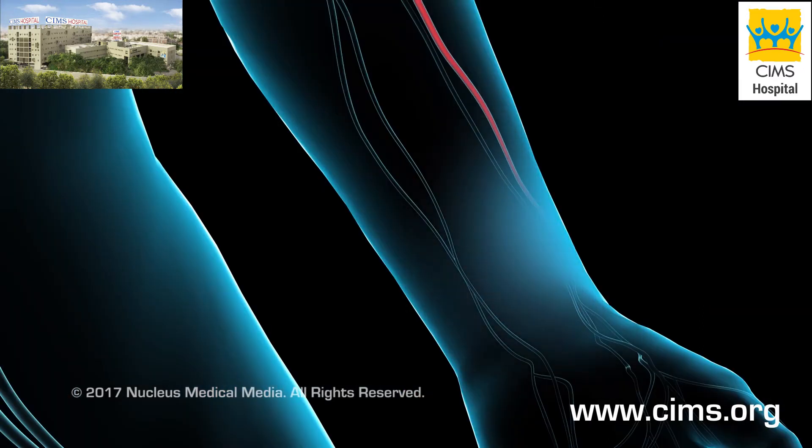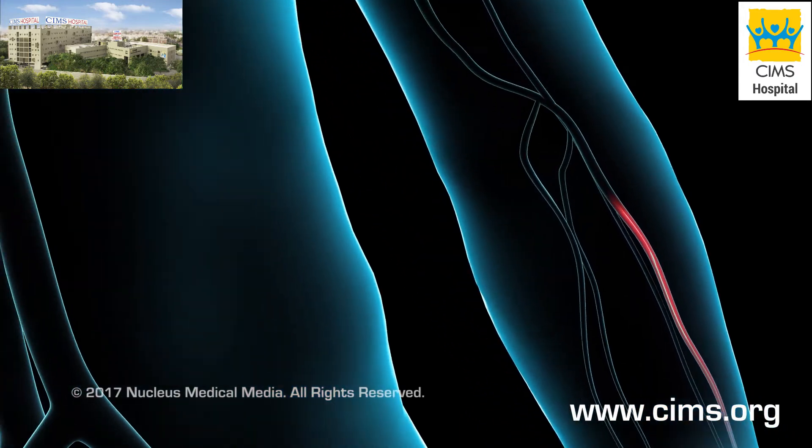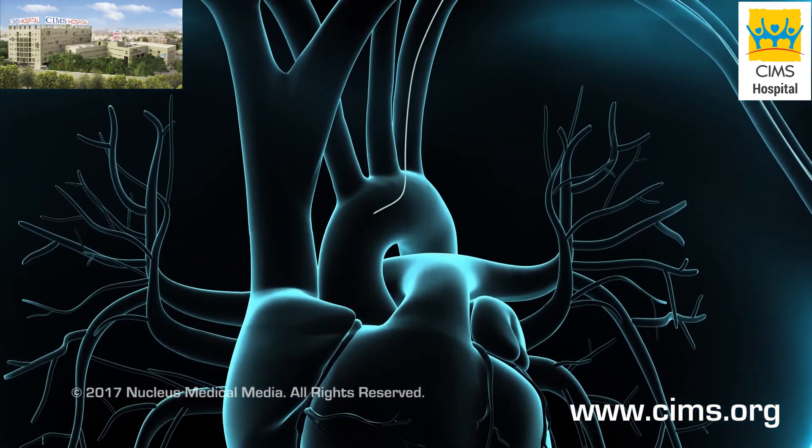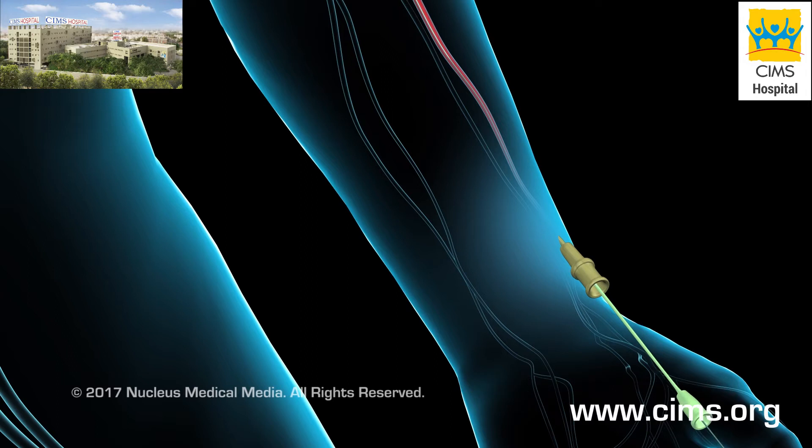To begin, the doctor will numb the skin in your wrist. A needle will be inserted into your radial artery. A wire will be passed through this needle. The wire will be gently guided through your arteries, to your heart. The needle will be taken out and replaced with a small flexible tube, called a sheath. This permits access to your radial artery.